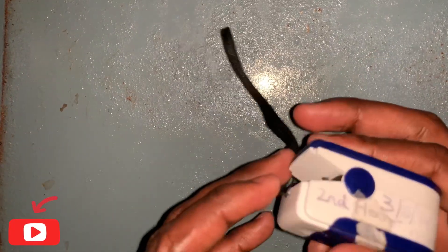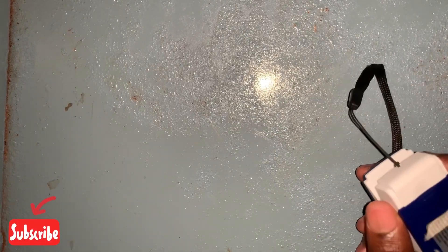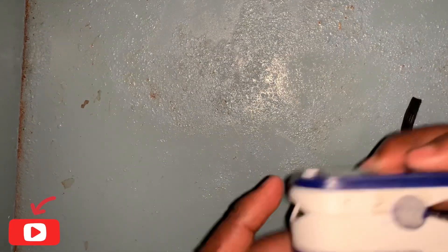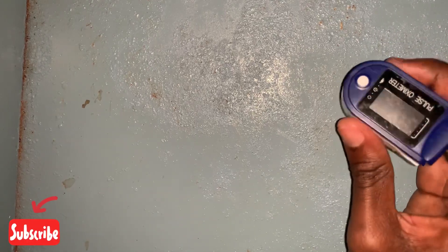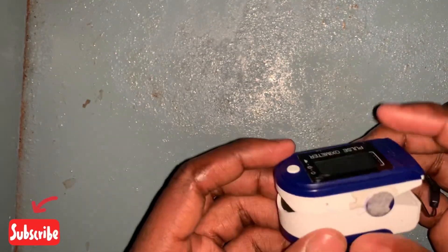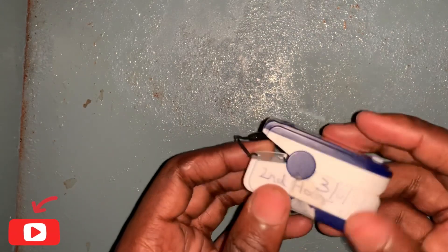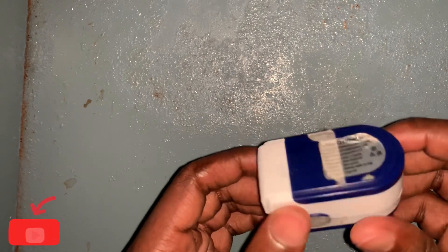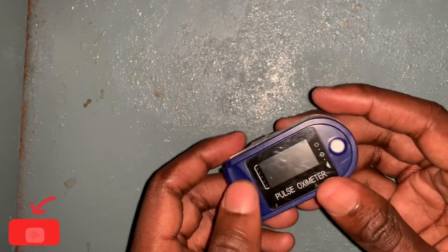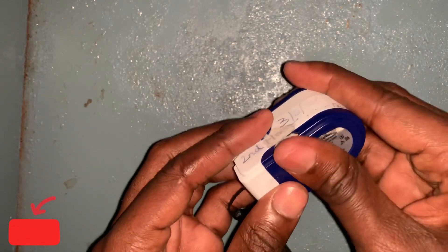Hello guys, welcome to Excellence Biomedical Engineering. On today's video we will be talking about this small device called a pulse oximeter. A pulse oximeter is a non-invasive device used in measuring a person's oxygen saturation. We will be talking about dismantling and reassembling this device. It is really an important device needed in the hospital because SpO2 is one part of the vital signs measurement done by physicians or nurses.